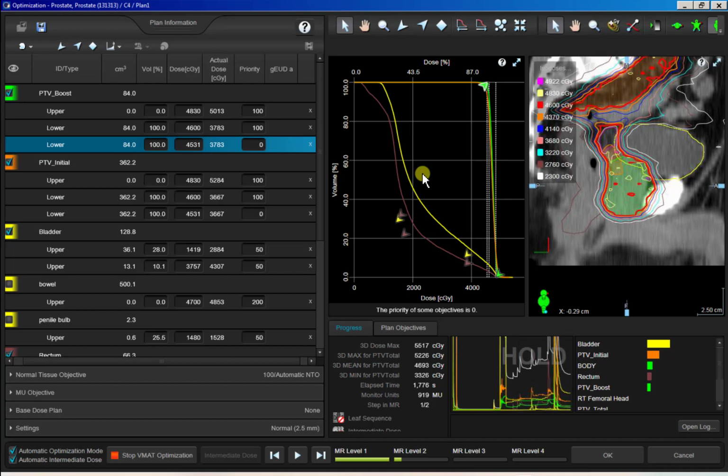Okay, that's how I know if I'm failing an objective. It's probably because it's just not possible, right? You need to push too hard, and then you're balancing that teeter-totter. You're pushing too hard, and then in level 2 you get it back just a little bit. Otherwise, if you never push harder, then you just don't know if you can get a better plan.